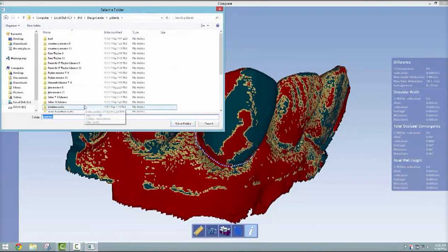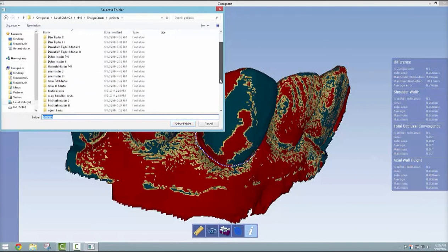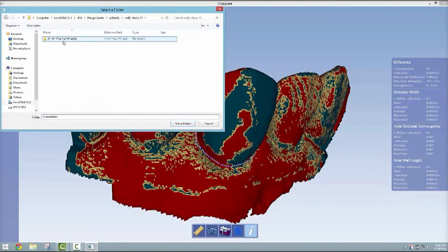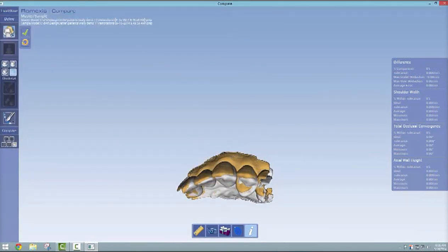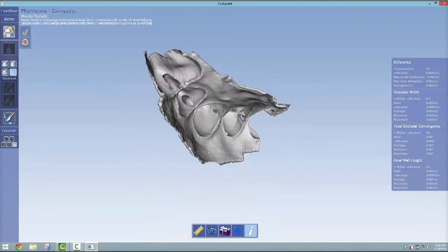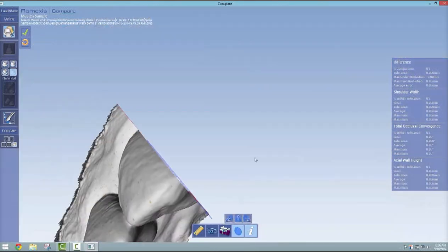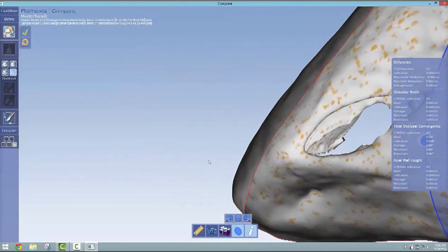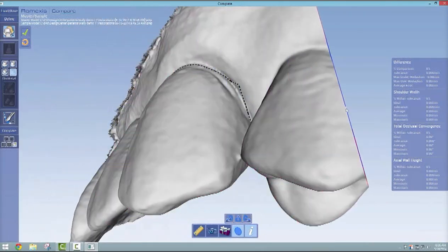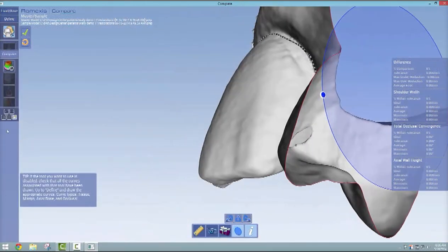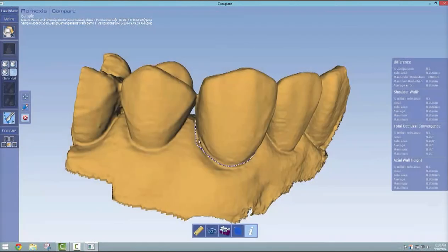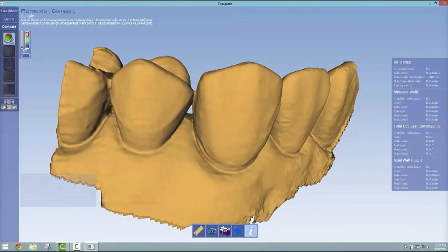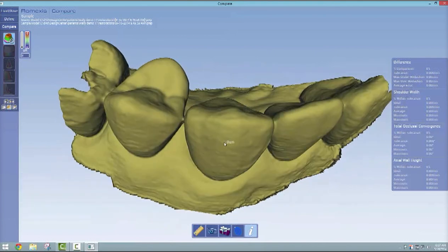Just to show you the accuracy of the stitching, if you pick the same model twice, we're having the same models here. Now we're going to align those two different models, and you almost can't even see them. If you zoom in really close you can see the speckled difference. There's no difference, so when it aligns those two models that are the same scan, obviously hopefully you would get zero on the difference map when you do the compare of the whole model.